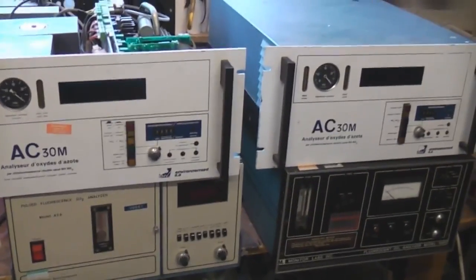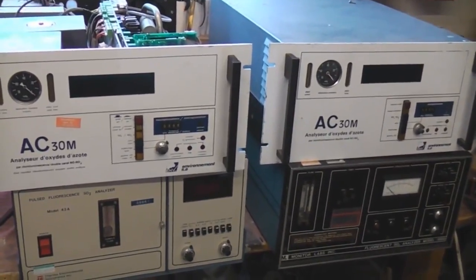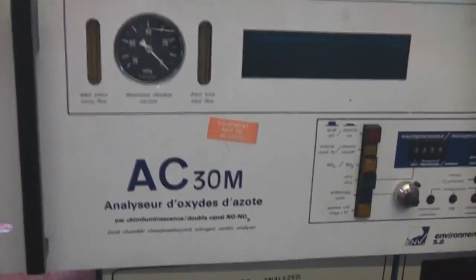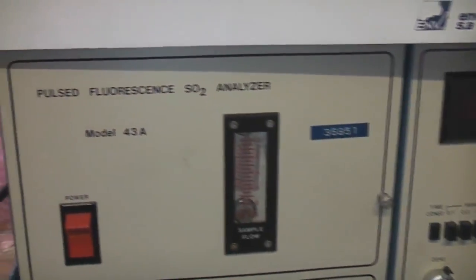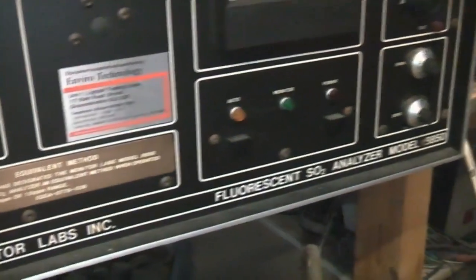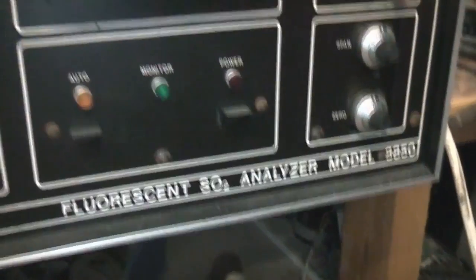Teardown time today, and here we've got some big old, formerly very expensive bits of laboratory kit. We have an AC30 nitrogen oxide analyser, and two different sulphur dioxide analysers. This is a pulsed fluorescent SO2 analyser, and again this is also another fluorescent SO2 analyser.